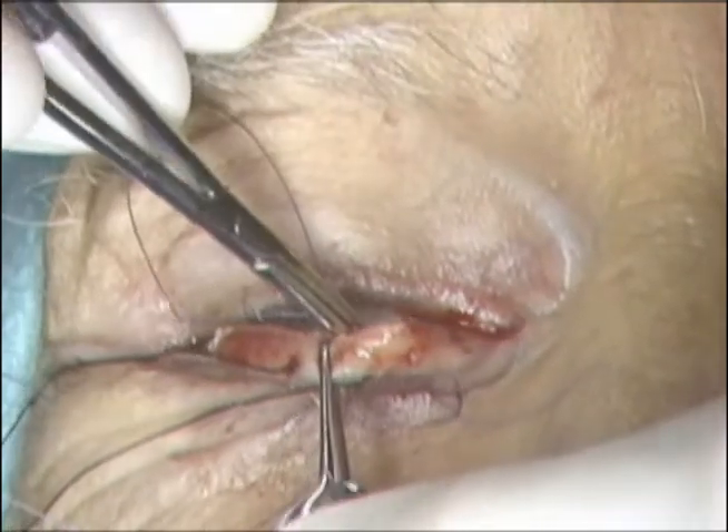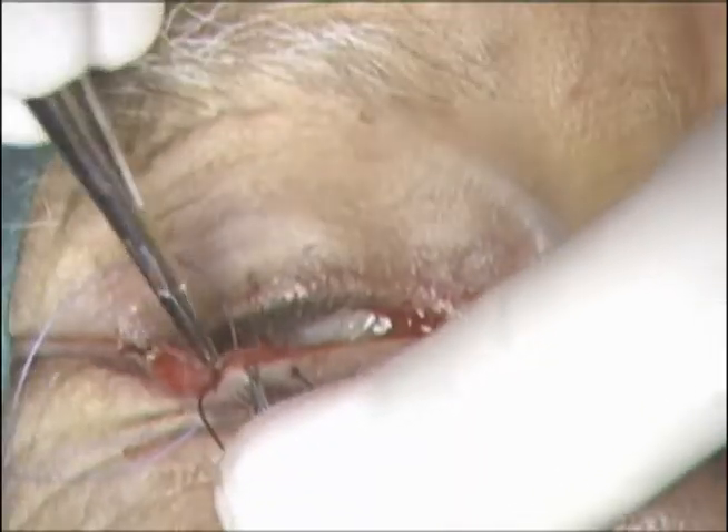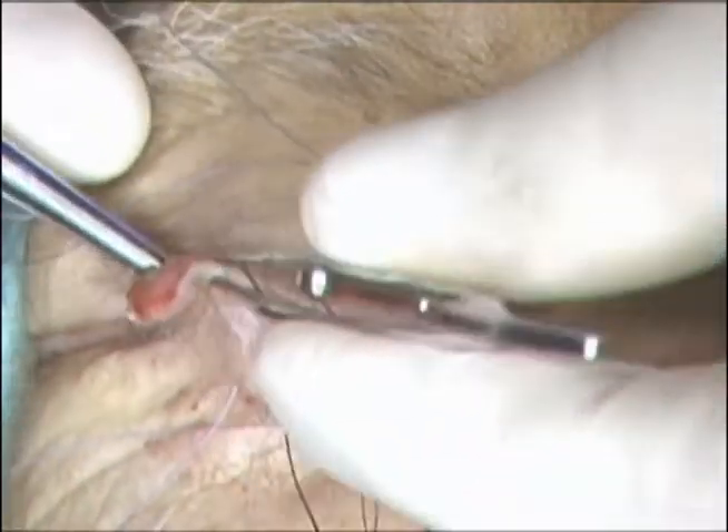The suture is then placed transcutaneously back through the orbicularis and skin to exit adjacent to the entry site. An additional suture is then placed centrally, again transcutaneous, followed by engaging the inferior border of the tarsus, followed by exiting transcutaneous. A third suture is then placed laterally. These sutures are left untied until the end of the case.